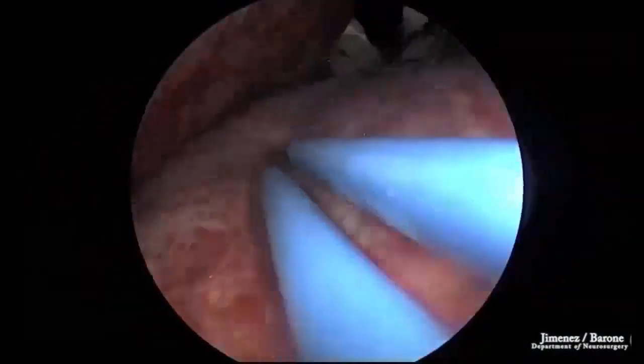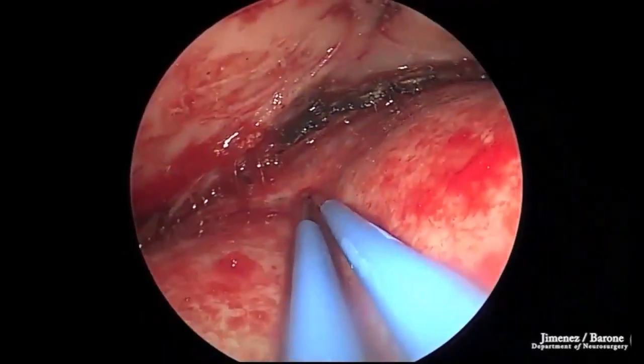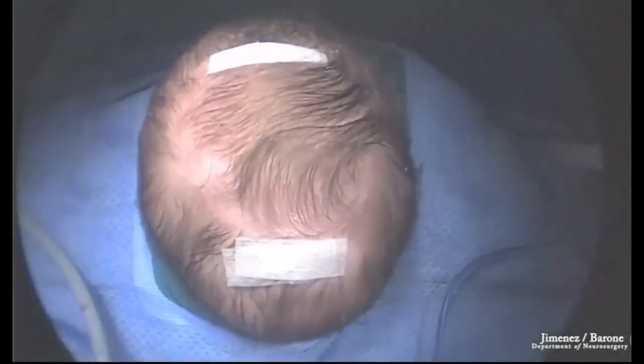At the end of the operation, the 30-degree endoscope is flipped to allow inspection of the dura and make sure that there are no tears or any bleeding. The incision is then closed with absorbable suture.